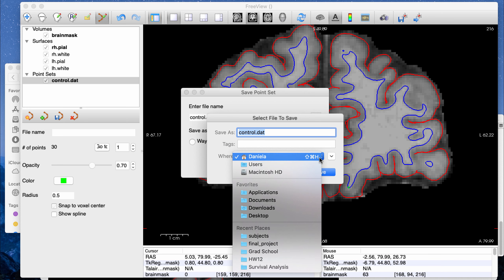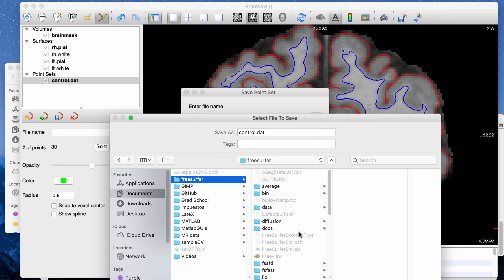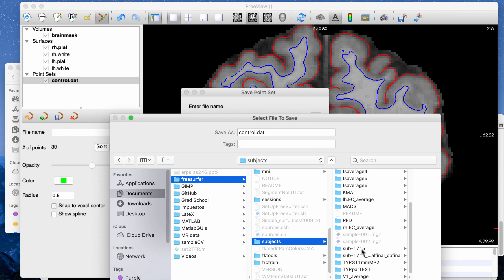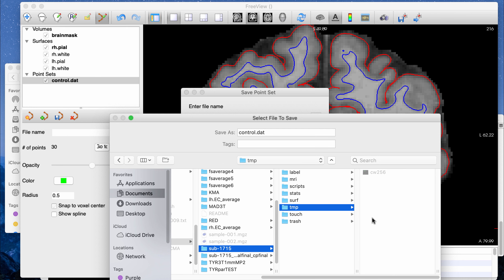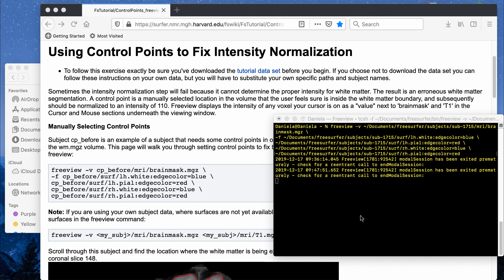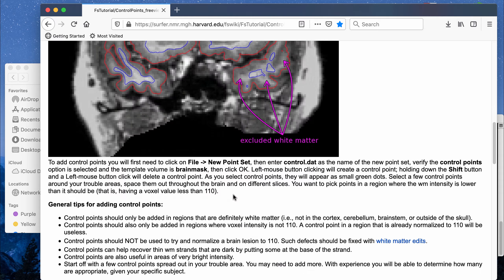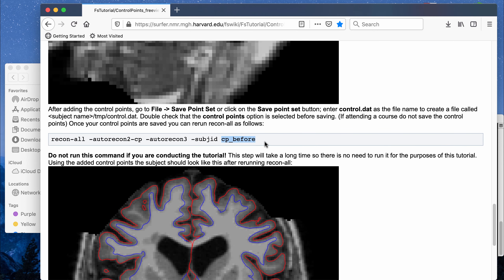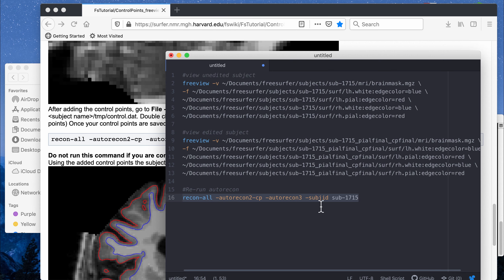To find it: go to your FreeSurfer subjects folder, cd into the exact subject you're working on — in my case subject 1715 — and there's a tmp folder that always has this file, and that's where you save control.dat. Once saved correctly, you can exit and run recon-all again. The command is: recon-all -autorecon2-cp -autorecon3 for your subject. That tells FreeSurfer to do stage 2 with control point editing and then stage 3 afterwards.